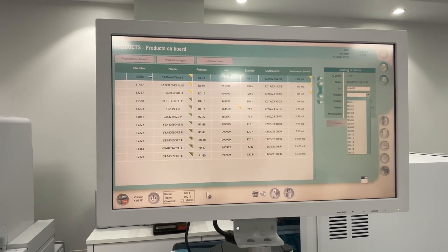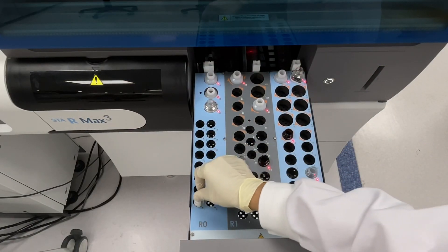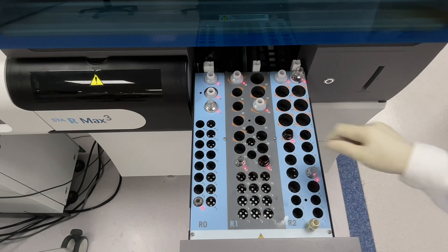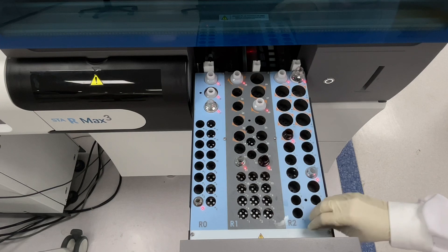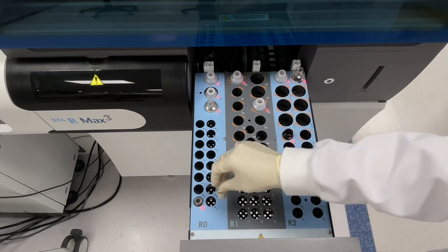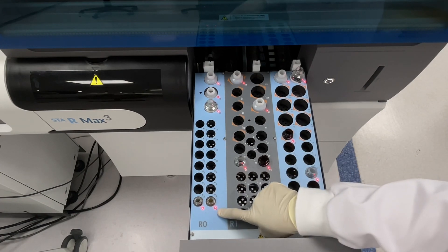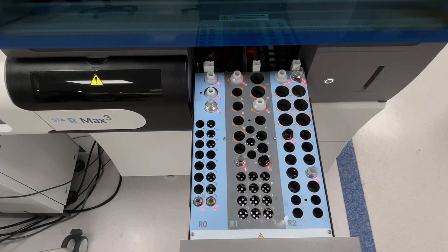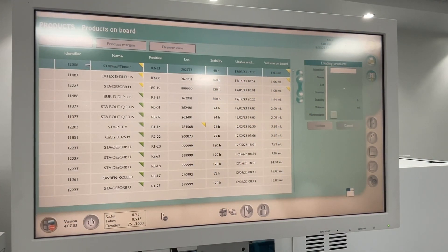Select any position, for example R01, then add your sample here at R01. A red light means your sample was accepted. Read the barcode the same way - a red light means your reagent is close to the reader.